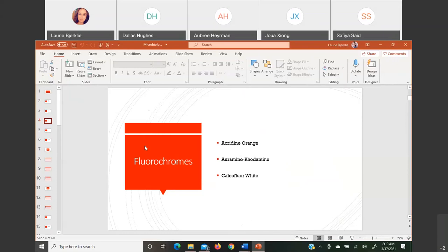All right, so I did have an answer here. So acridine orange will bind to the nucleic acid. So a lot of times this is used for a couple of different reasons. I think the main purpose a lot of labs use it is in blood cultures to kind of scan, if there's a positive blood culture, to scan and see if there is bacteria present. Another reason to do it is if you have mycoplasma. Mycoplasma, remember, does not have a wall, so you can't gram stain mycoplasma, but you can use acridine orange and it'll bind to the nucleic acid in that bacteria and highlight that they are there. So just kind of a couple different purposes. From what I've learned from different people in different labs, a lot of people use it for the blood culture part with acridine orange.